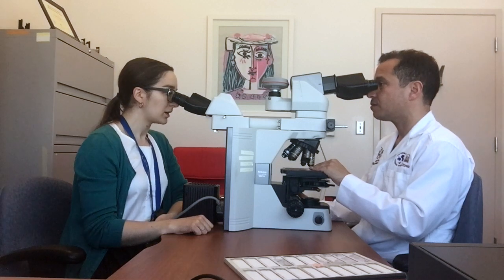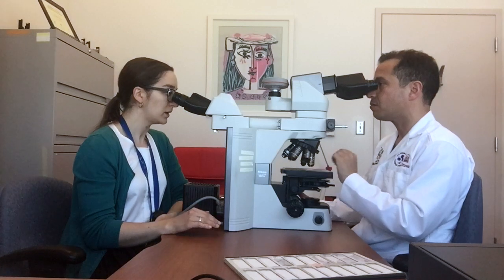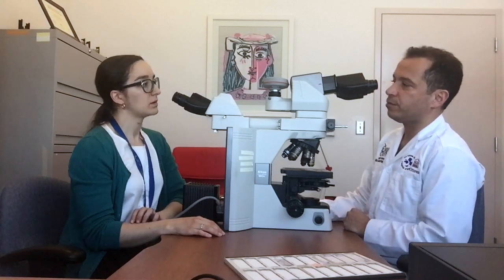There's nothing cytologically or architecturally about what we have sampled here that clearly tells me that it's one or the other. So at this point in time, I have adenocarcinoma, but it could be primary, it could be metastatic, and I would want to do immunohistochemistry to figure that out. Okay, that's a good idea. But is there something that we could do before immunohistochemistry?